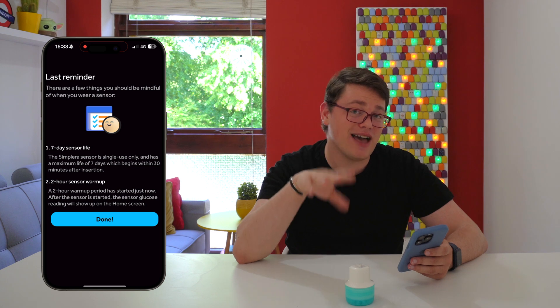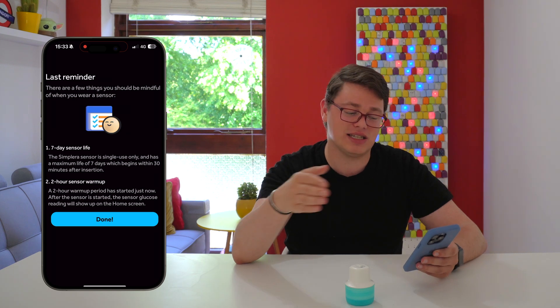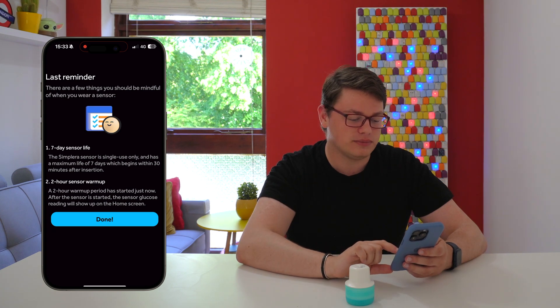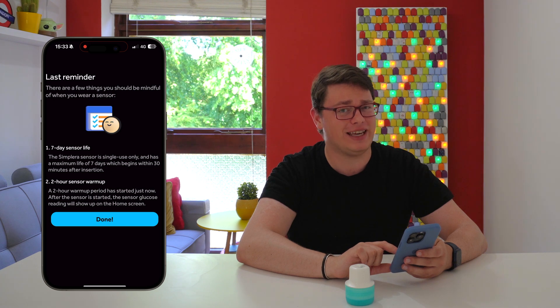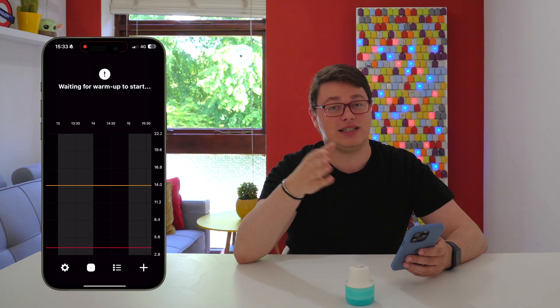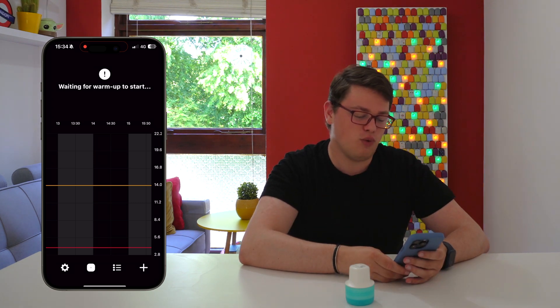It's a 7-day CGM, which is actually much shorter than other CGMs. Dexcom is at 10 days and Libre is obviously 14 or 15 days — this is still a 7-day CGM. And it has a 2-hour warm-up period, which again, when you have the G7 today at 30 minutes and Libre at an hour, 2 hours still feels a bit old-fashioned. And there it is, waiting for warm-up.